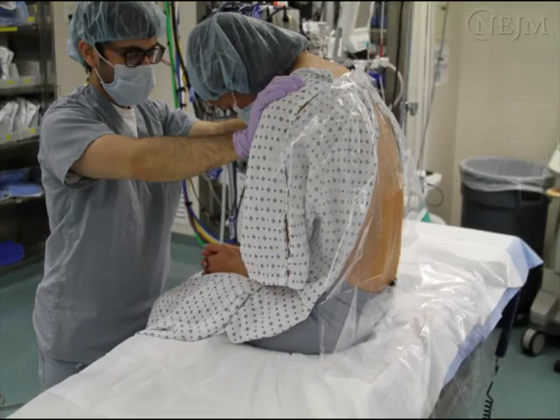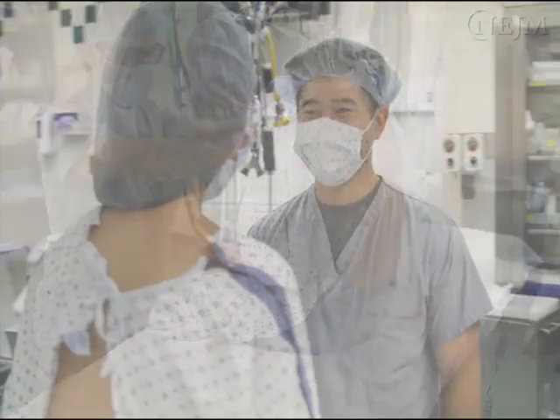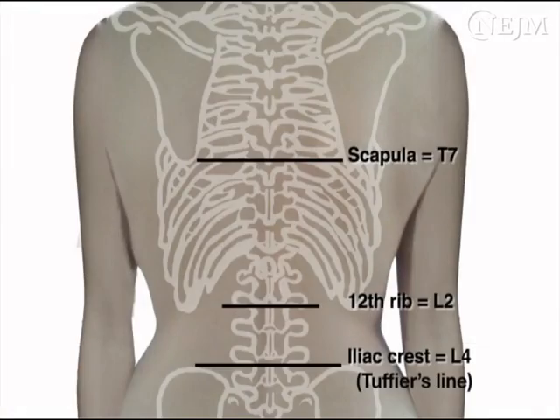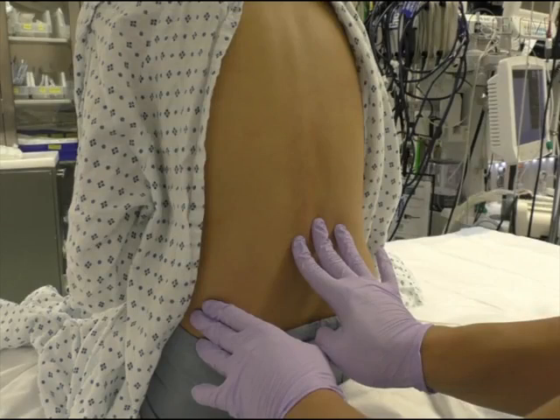Placement of a lumbar epidural catheter requires knowledge of the indications and contraindications, familiarity with the equipment, and knowledge of the relevant anatomy. It can provide significant benefit to patients during surgical procedures or childbirth.